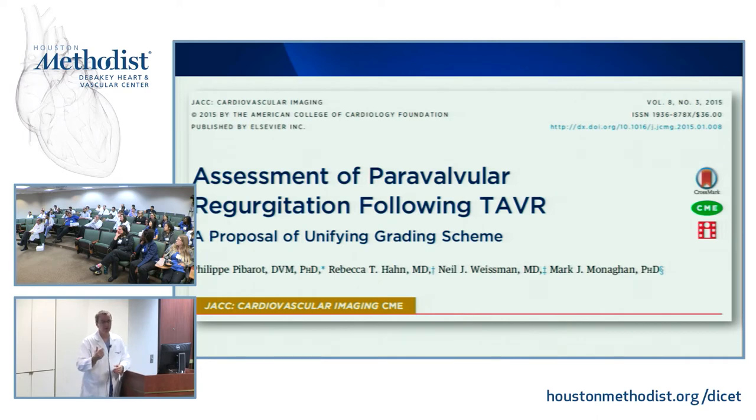But in an 80-year-old with a stiff, non-compliant ventricle. So that's one thing that we have not done well. Guidelines have not yet addressed, and the field hasn't solved yet, how to index AI for the ventricle that's receiving the amount of fluid. Right. So we have to recognize that a little bit of fluid in the wrong ventricle can be hemodynamically significant.